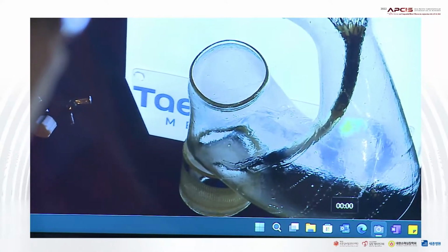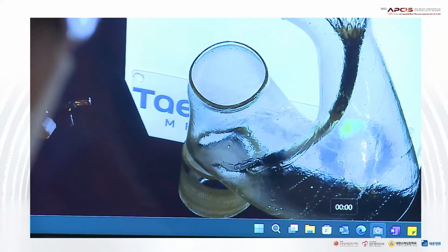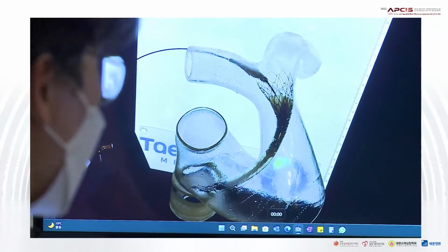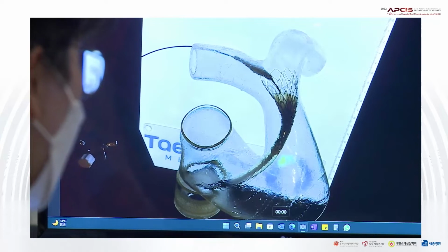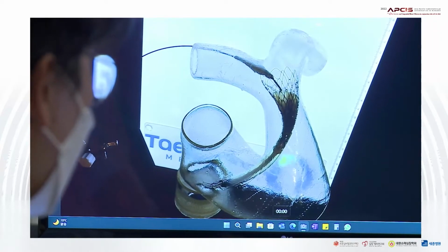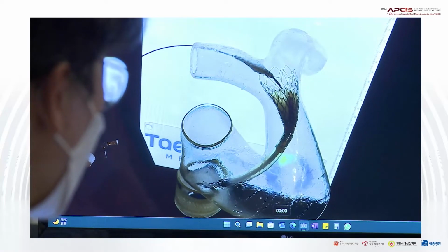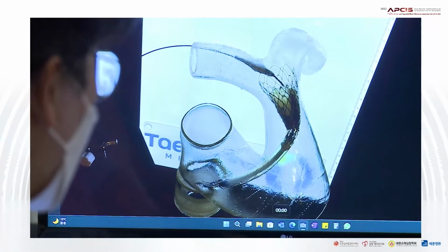So normally the operator will check the position by angio, a quick angiogram. And now you can see Dr. So-Ick is opening the valve more and more and more, and now it's almost ready to release in the next few seconds.